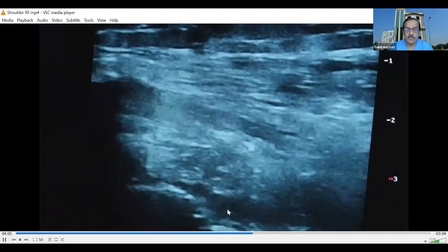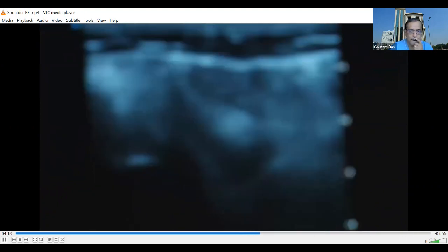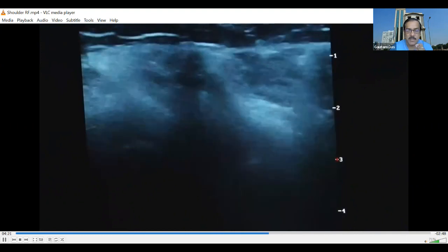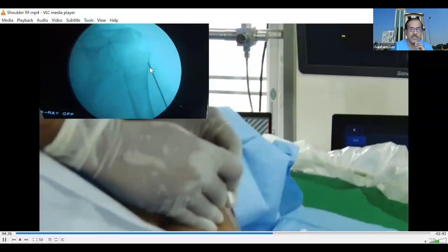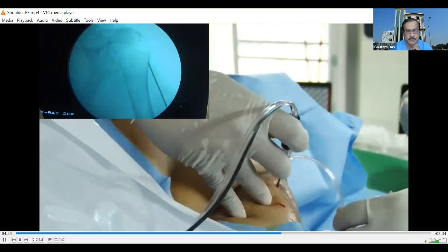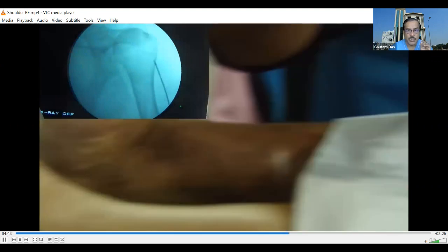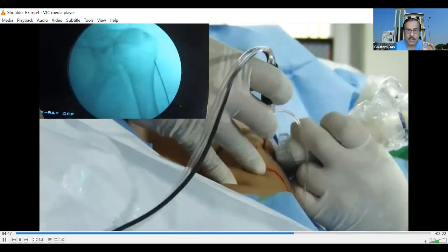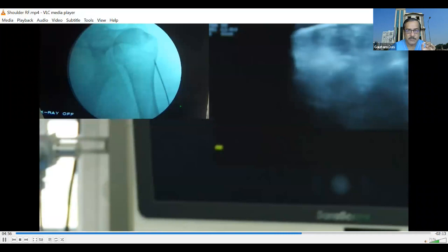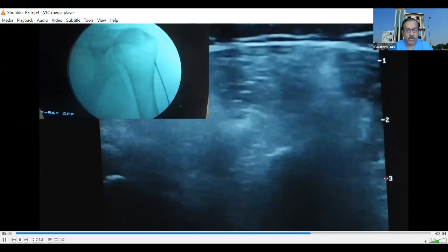After infiltration of local anesthetic, our target is confirmed. The arterial pulsation may not be very prominently seen at this point. Radiologically, our target is at the junction of the shaft and the head of the humerus — specifically the lateral aspect at the head-shaft junction. This is an excellent position. After sensory and motor stimulation, we proceed with lesioning at 60 degrees tip temperature for two and a half minutes. After completion, we again inject a small amount of steroid to prevent deafferentation pain. This completes the ablation of the articular branch of the axillary nerve.